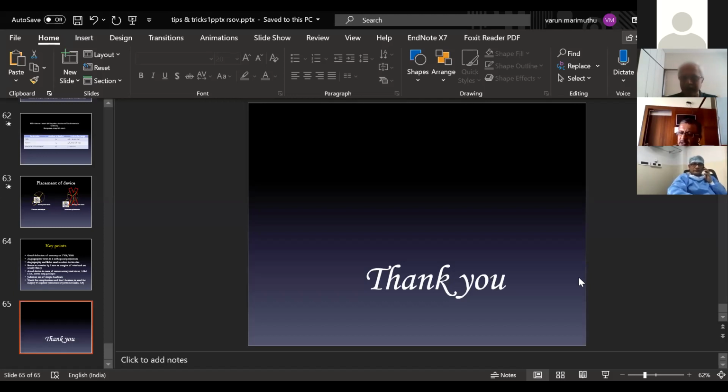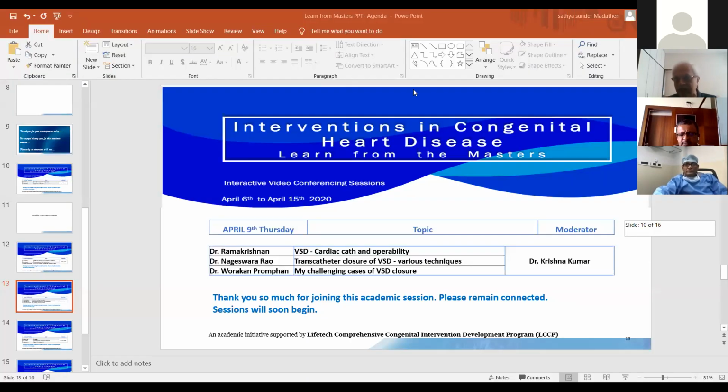At the aortic end, because as you showed in one of your slides, to close the ruptured sinus you must close the aortic end and not the point of exit. Yes, for 2 reasons. One is the stability of the device, and second, even if the device is stable, if you close it downwards, you will not take care of the aneurysmal sac. Absolutely, and that can be a potential for thrombus formation. So I think it is very clear that we should close it at the aortic end.